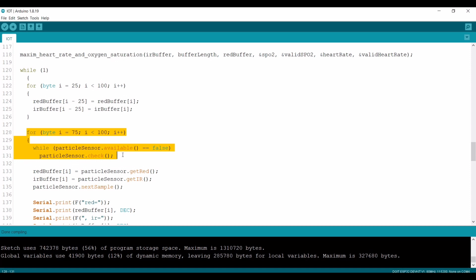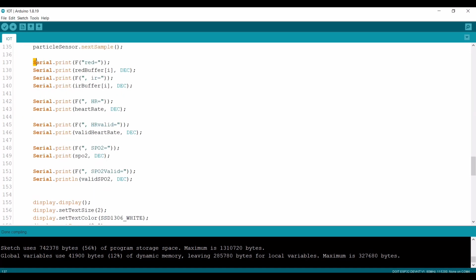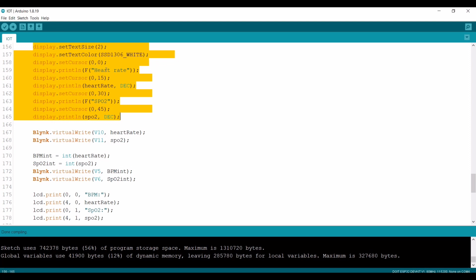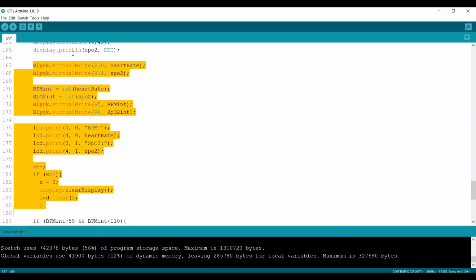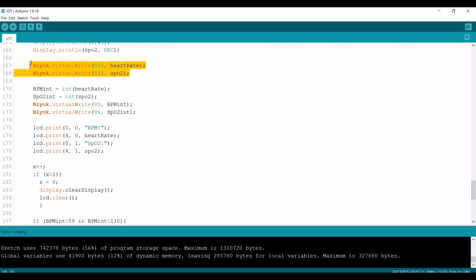This one takes 25 sets of samples before calculating the heart rate, and checks whether it has the data or not. If not, check the sensor to receive new data and get these two values again. If finished, go to the next sample and send samples to the serial monitor. Display the heart rate and the SpO2. This one is for the Blynk application. I need to show the heart rate and the SpO2 value in terms of a string in a value display of the mobile Blynk application. And this one I want to show in a gauge, so I need to change the data type into an integer first before displaying it on the gauge.